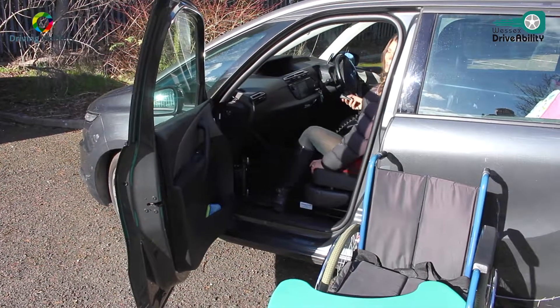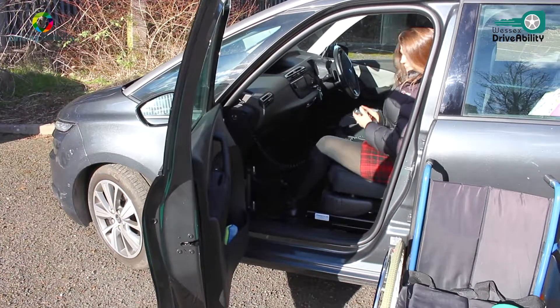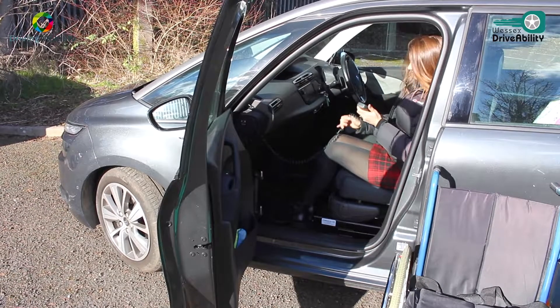It just slides back into the front. It's very straightforward. And there we go — immediately in the front passenger position. Absolutely. That's brilliant, thank you very much.